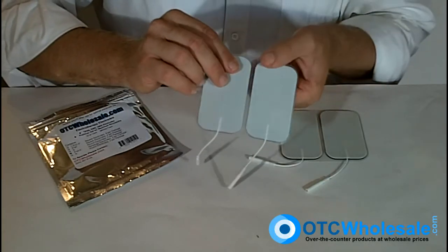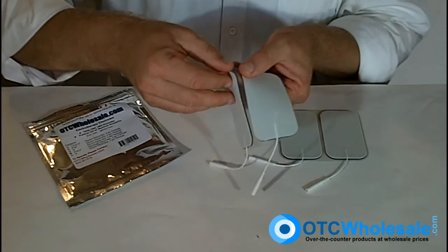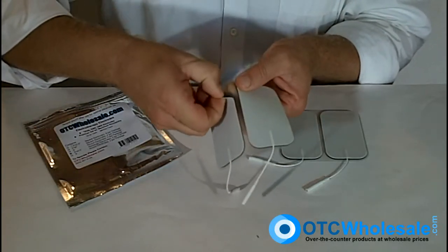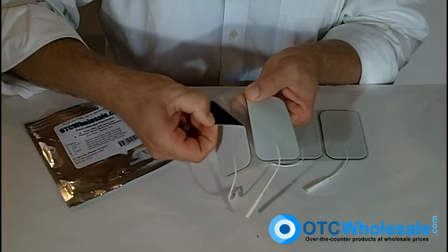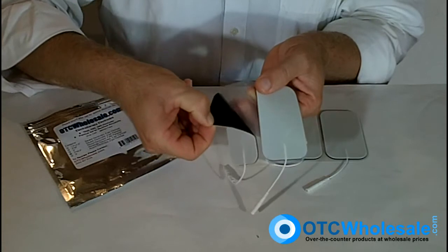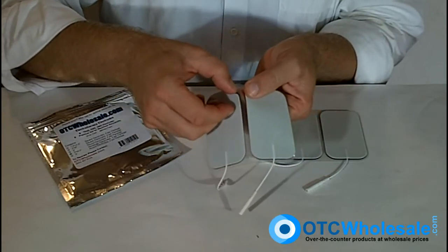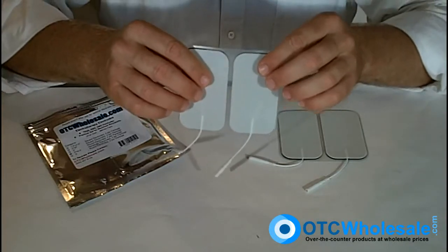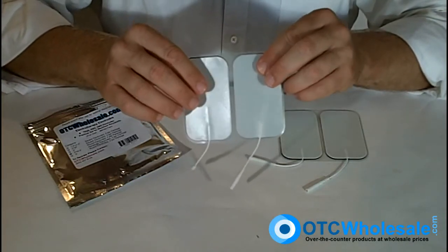In order to remove this electrode from the plastic, just grab it from the opposite end from the wires and pull it back. You'll see that beautiful American-made gel that affords the electrode such great reusability. You can get as many as 10, 15, even 20 uses out of an electrode with proper care.